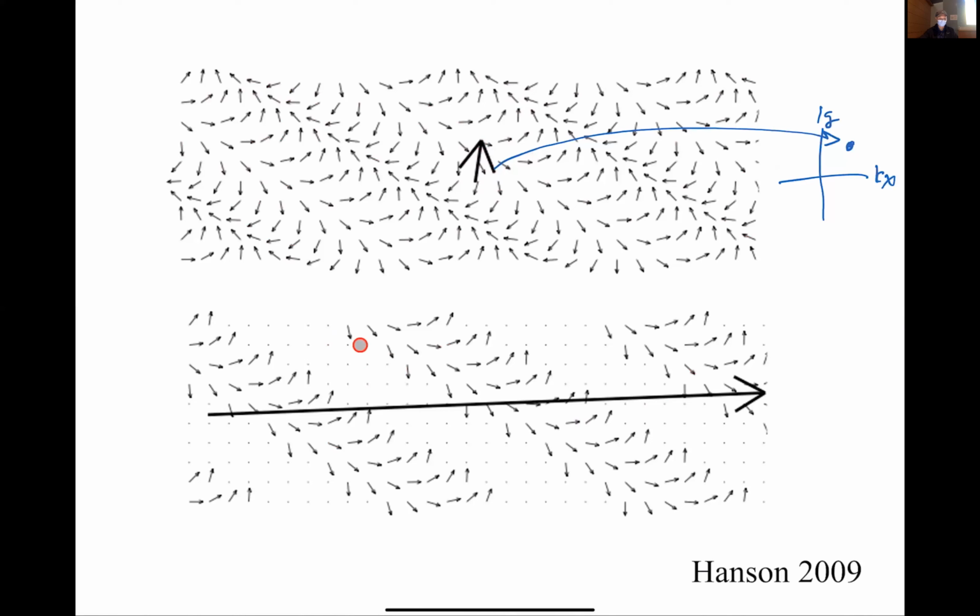And now when you think about it, when we add up all these components, I get a really big value for my Fourier component, because now my object matches my Fourier component. Okay. Does everyone see that?